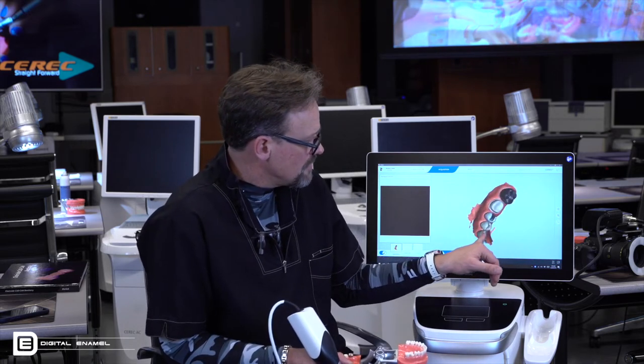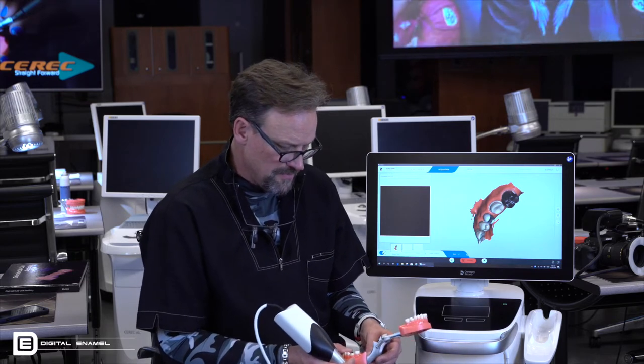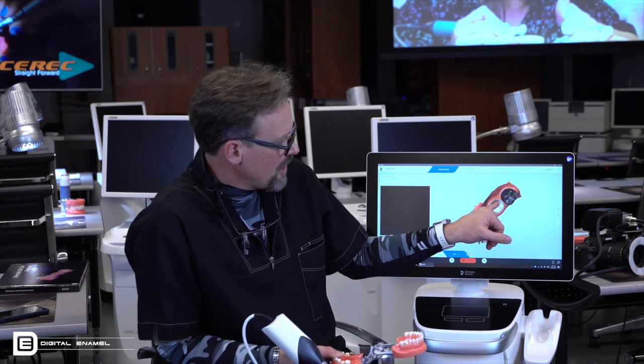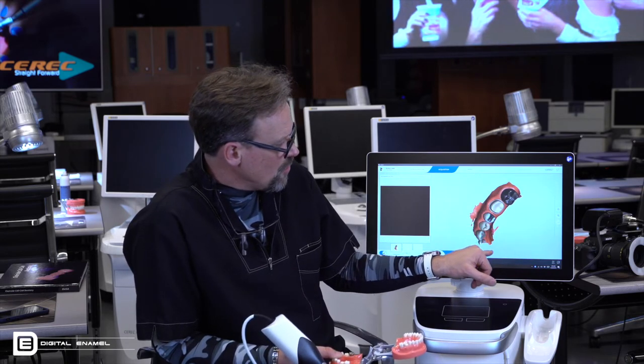All right, next thing is, and this has been percolating through the internet for too many years. It drives me crazy when I hear people say, well, if I'm going to do a crown on number 30, I have to image all the way to the contralateral canine to do that case. No, you don't. You do not at all.